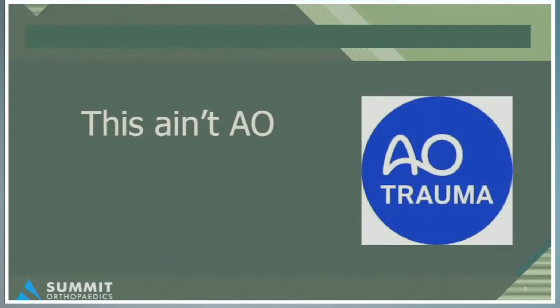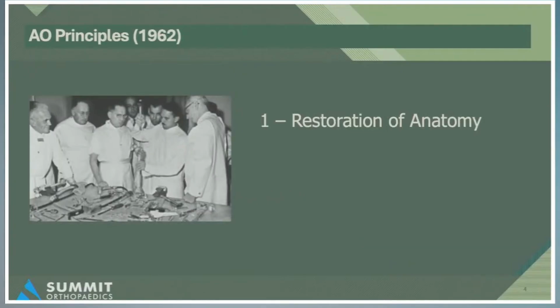Traditionally, this stuff was not taught in my residency. Like I said, I was taught fractures heal with compression and compression only. So the idea of an external fixator, which has relative stability, was just kind of hearsay. You'd think it would not be within the AO principles, but if you take a closer look, the Ilizarov principles are the same as AO principles. Based in the 1960s: restoration of anatomy, you can control the anatomy with the frame, stable fracture fixation.